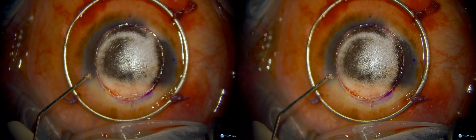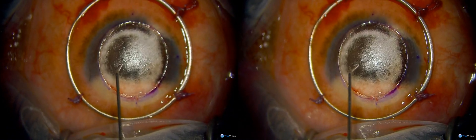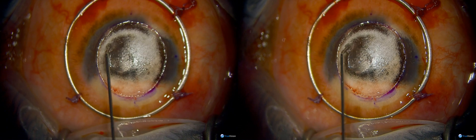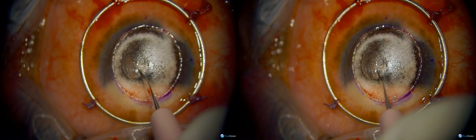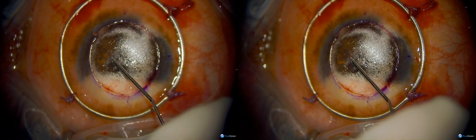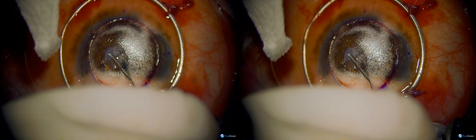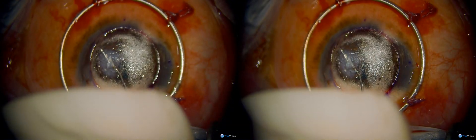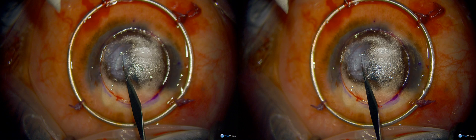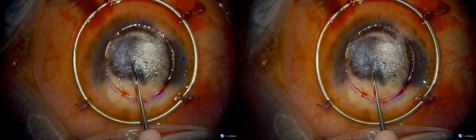The next step here is going to involve doing the bevel slash, and she's going to try to decompress the anterior chamber a little bit and get the eye a little bit softer. There's some viscoelastic she's putting over the stroma to help slow the egress of air once the bevel slash is made. You can see that area decompresses rather quickly. Now she's using a cannula and injecting viscoelastic to create some space to extend that initial incision. This can be done with scissors that are blunt on the bottom side so that you don't cut Descemet's membrane, and it's always good to keep refilling that potential space with viscoelastic so that you're creating enough space where you don't cut Descemet's membrane.